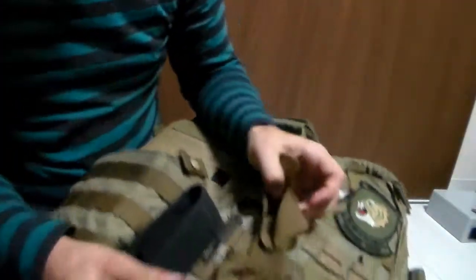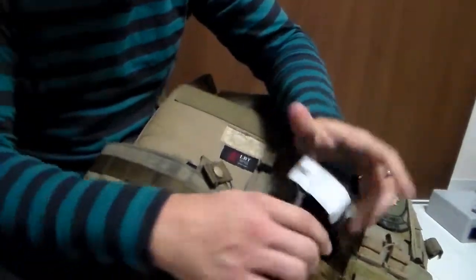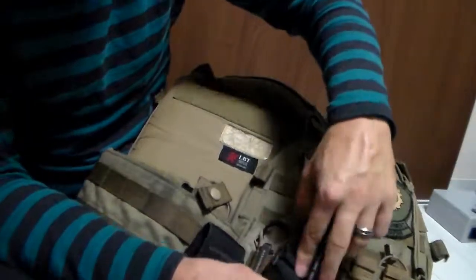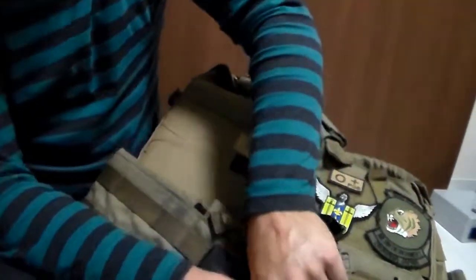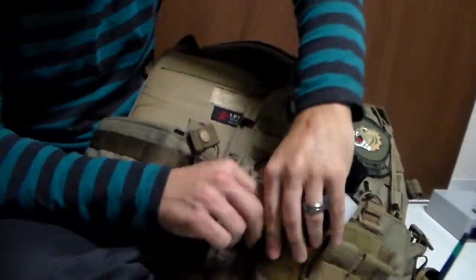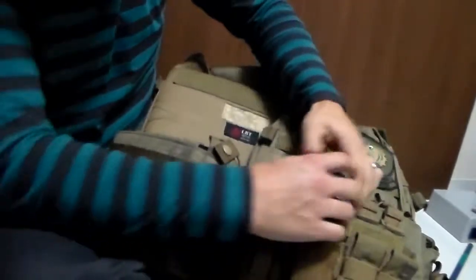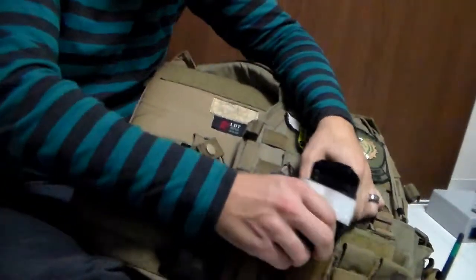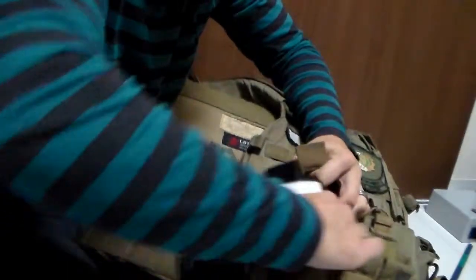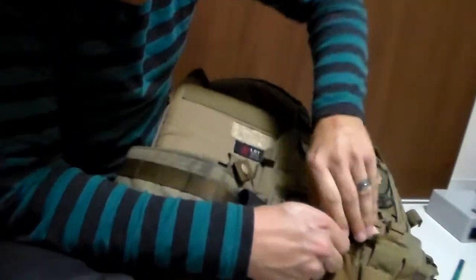This one has the same concept except now you have an open-top case that'll actually cover all of the tourniquet. So that if you're in a field environment and stealth is an issue, black does kind of stand out quite a bit — and especially the white most certainly will.